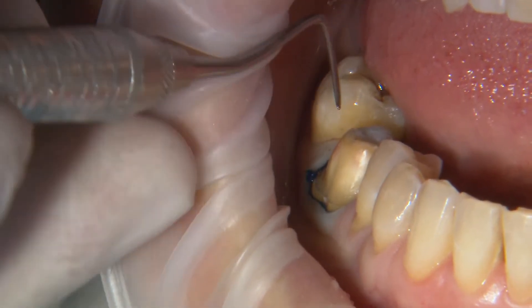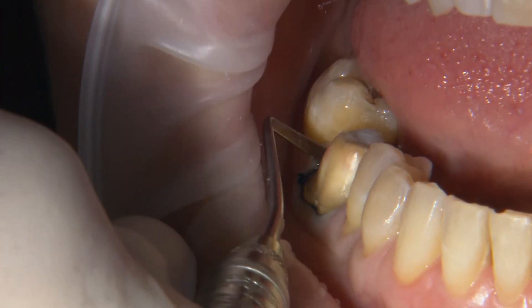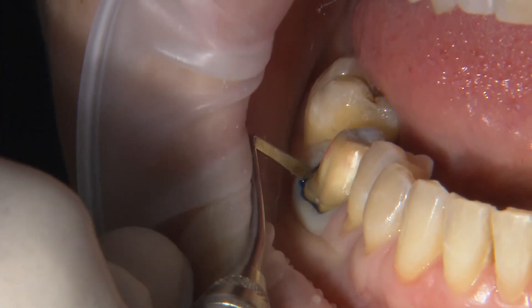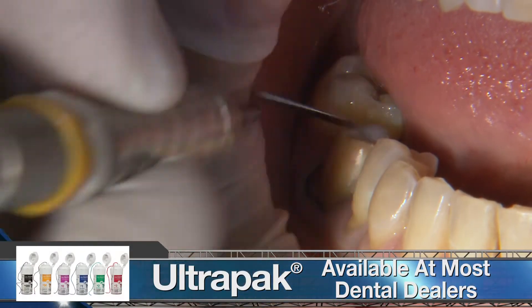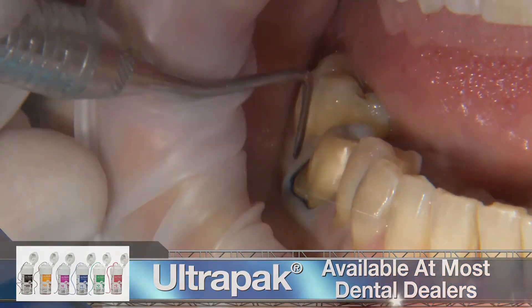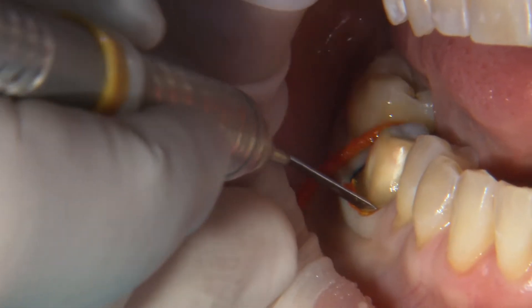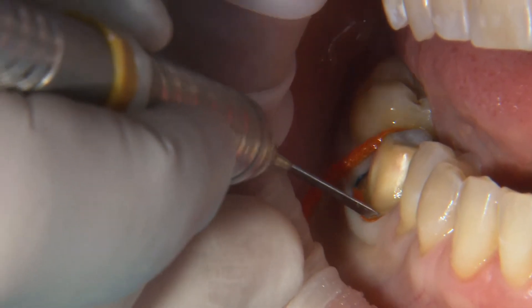For those dental assistants that are an expanded function, this applies to you as well. The first method recommended by our doctors is the dual cord technique. The initial cord is packed, preferably with a hemostatic agent impregnated into it, and then cut to exactly contour the margin. A second cord is placed over the first with just a little extra tail left hanging out to make it easy to remove before scanning.